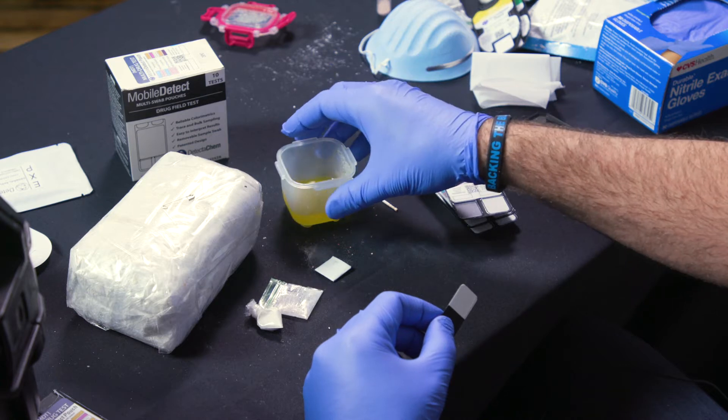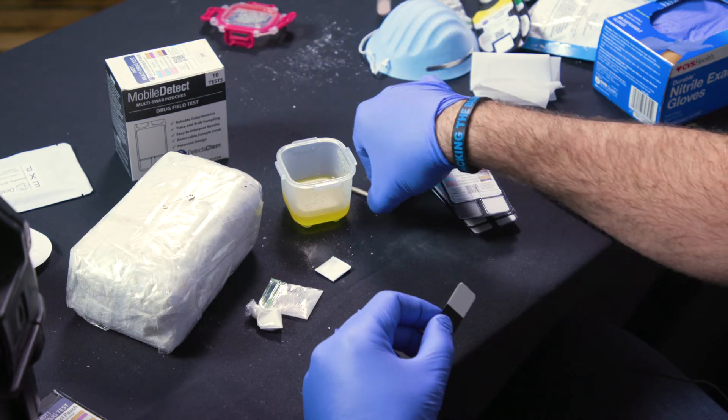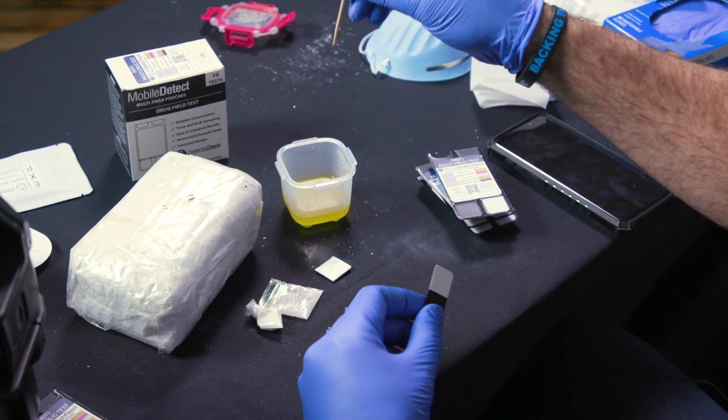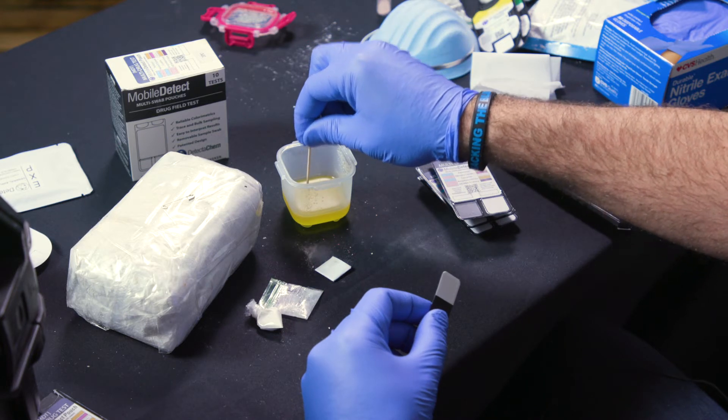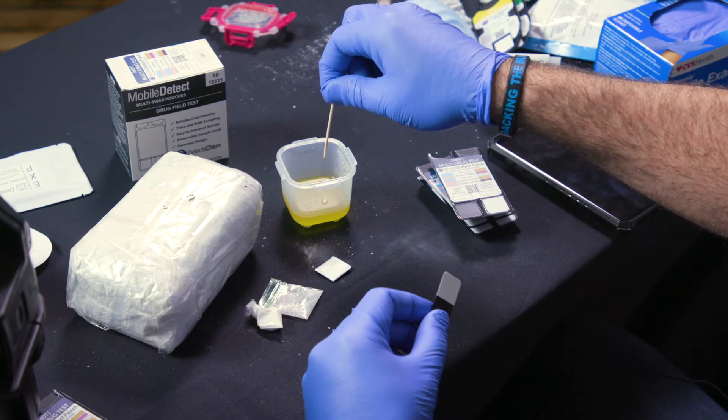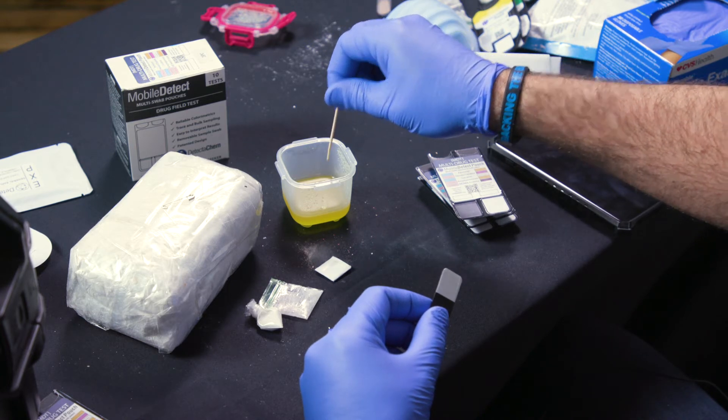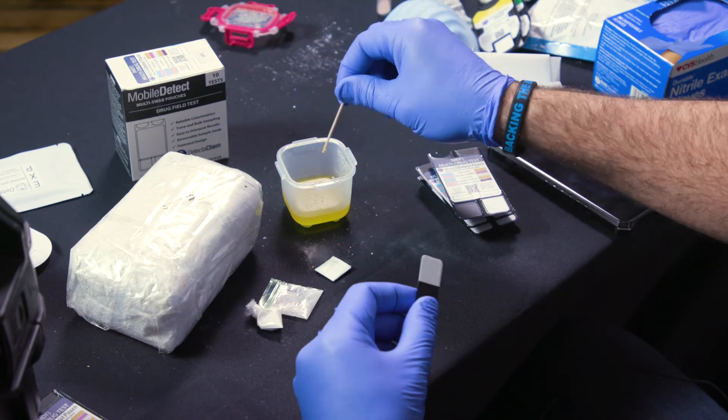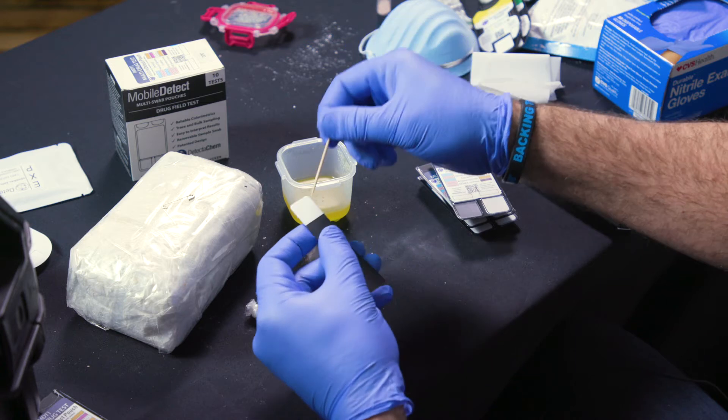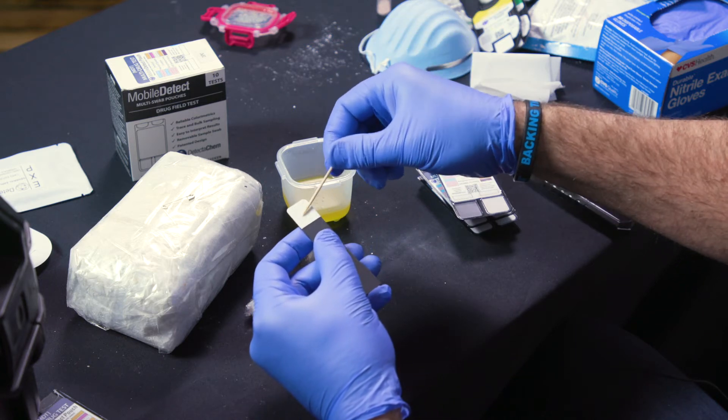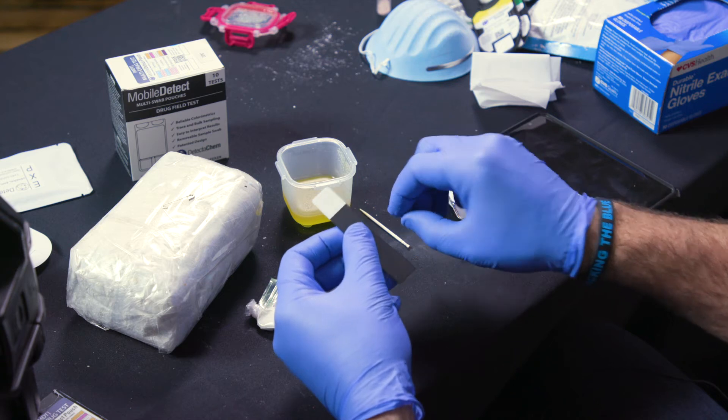Dab, shatter, even vape pen fluid, toothpick, cotton swab, whatever it may be, and this would be the same for a final reaction in a one-pot meth cook with the Coleman fuel. Just something that you can just get a little bit of the liquid on there. Wipe that liquid on the pad and that's all you have to do.